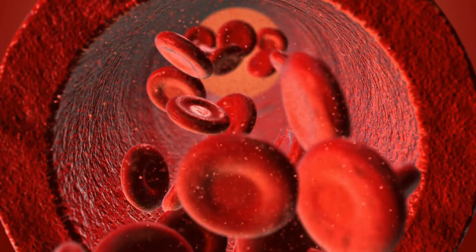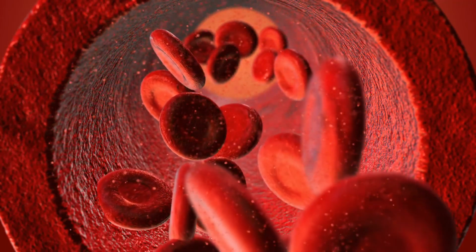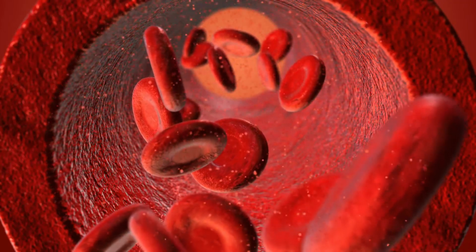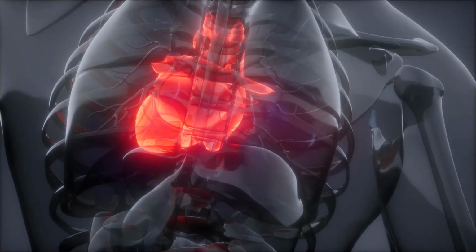This is how the carotid artery Doppler evaluates blood flow. It uses the change in wavelength to determine how fast blood is flowing through the arteries. Knowing the speed of the blood flow then allows the user to determine whether or not the blood is flowing through the arteries at normal levels.